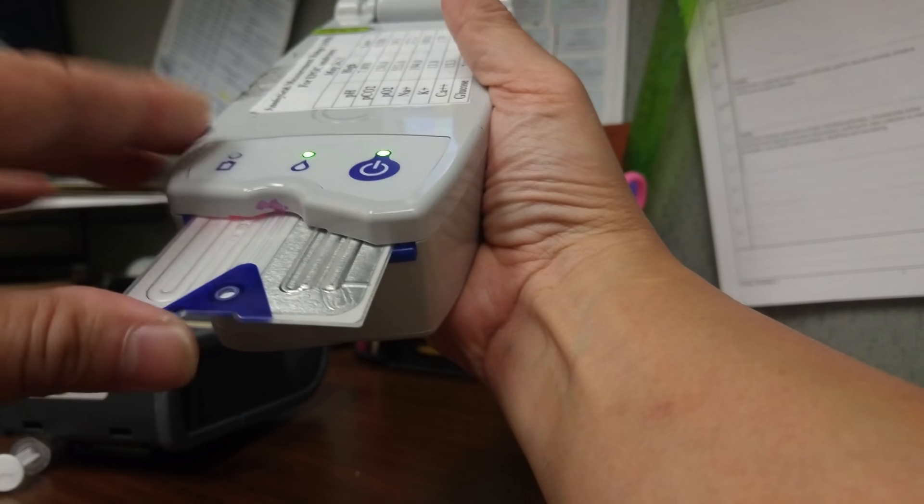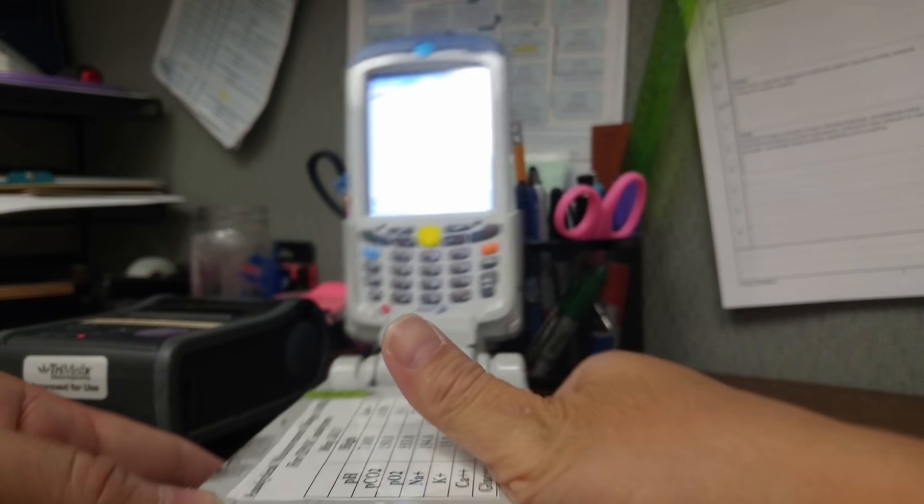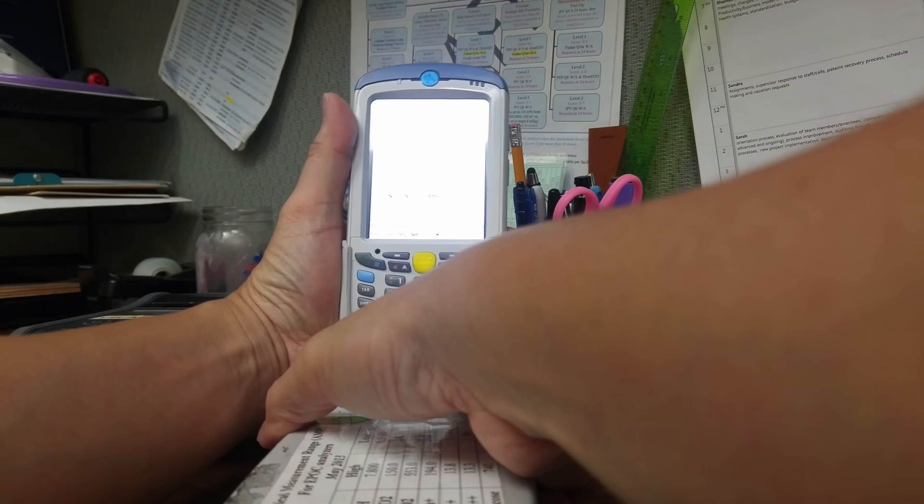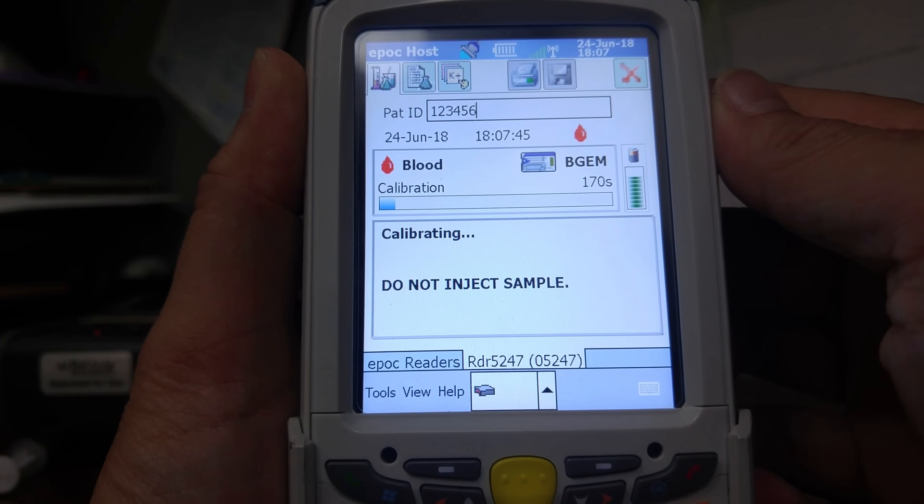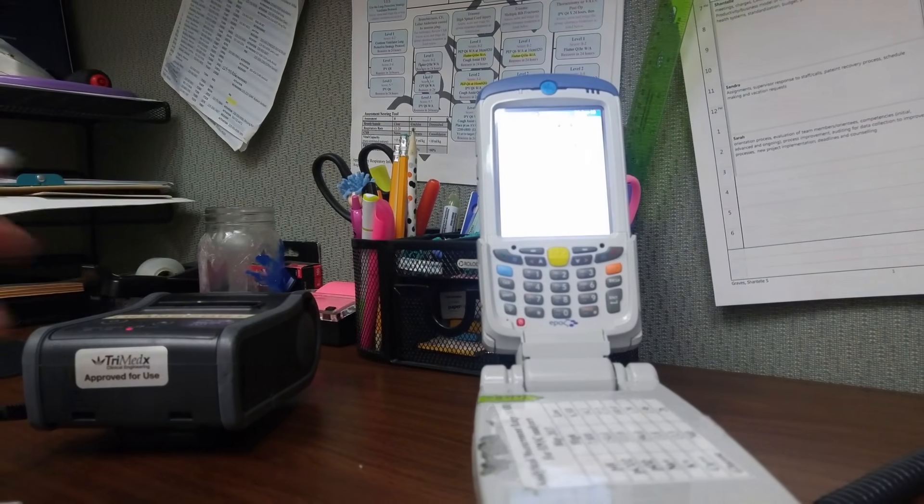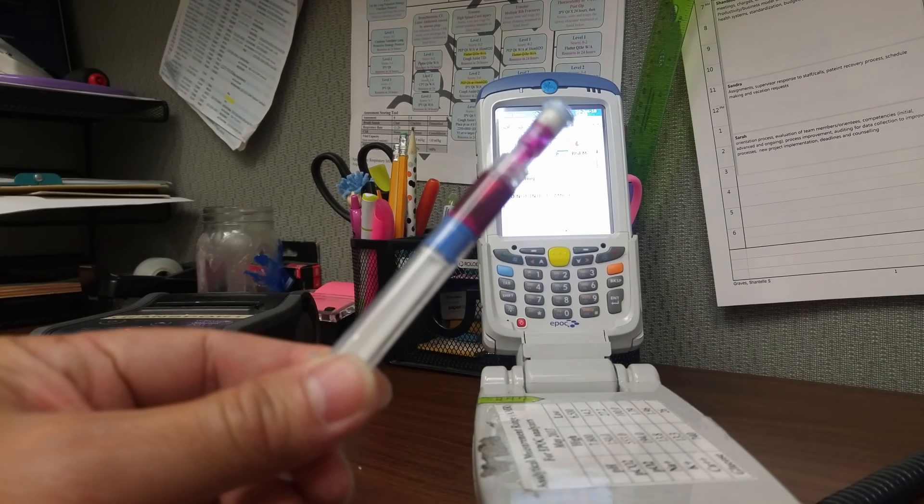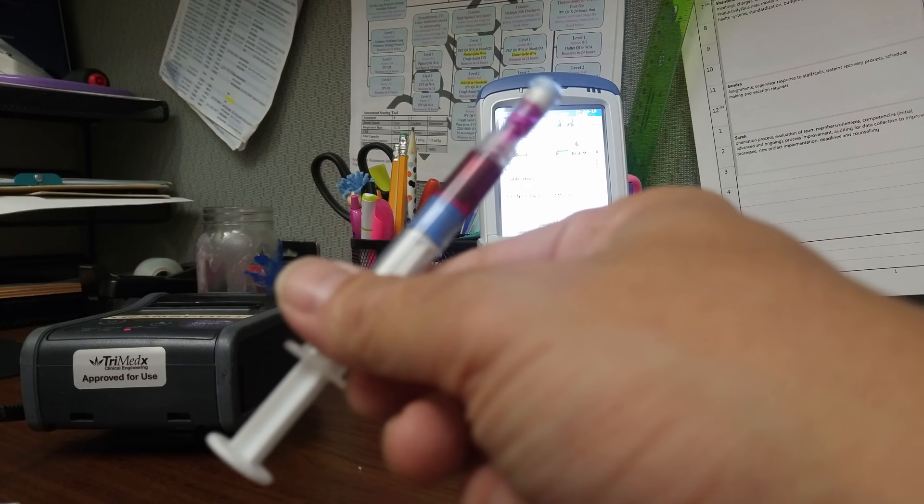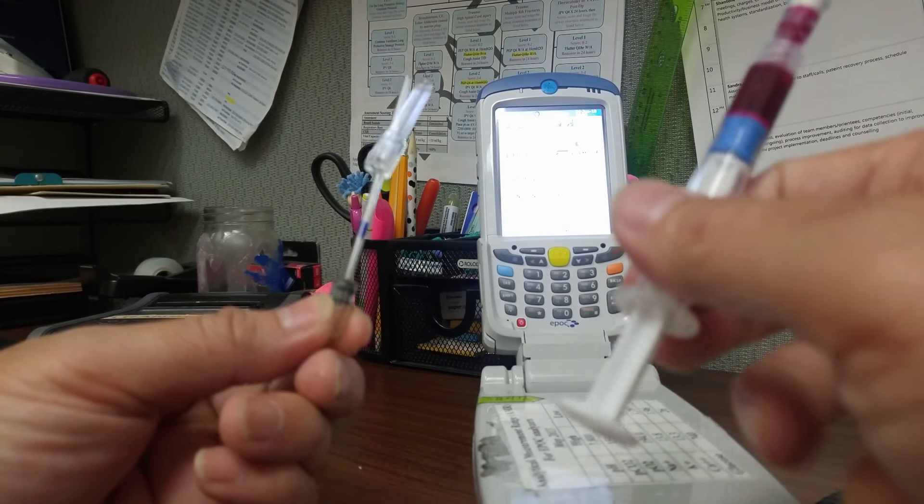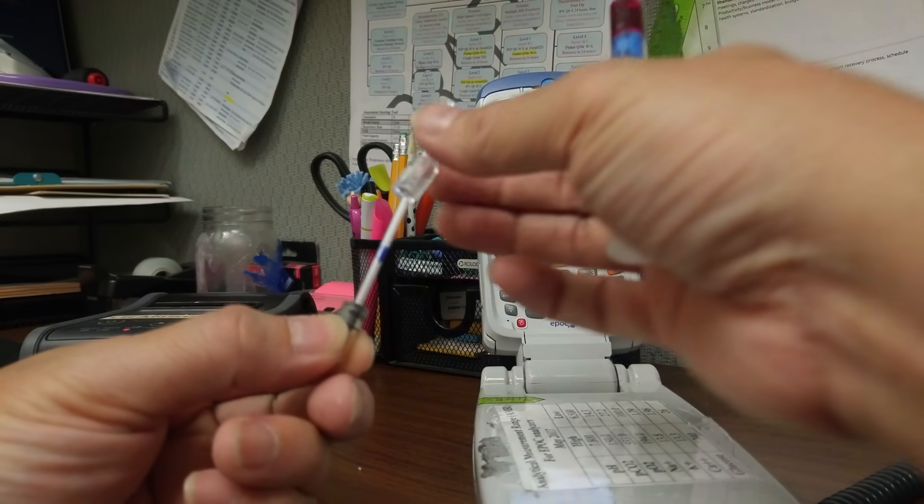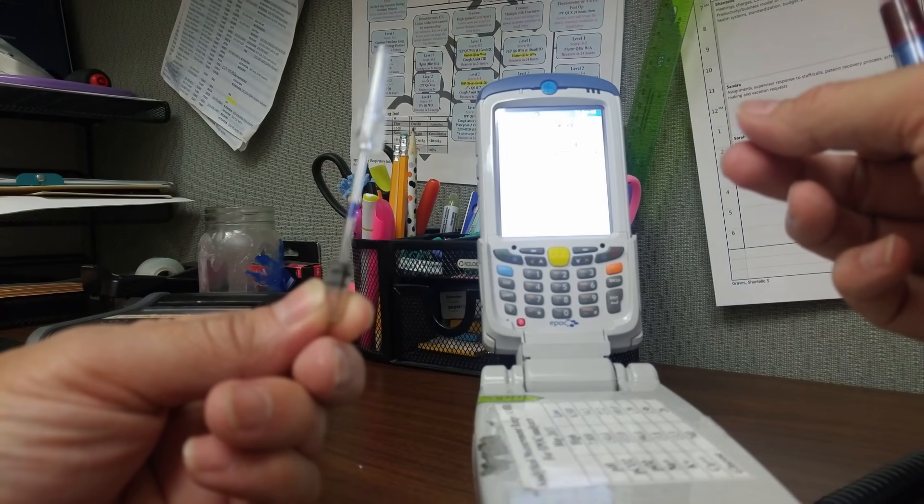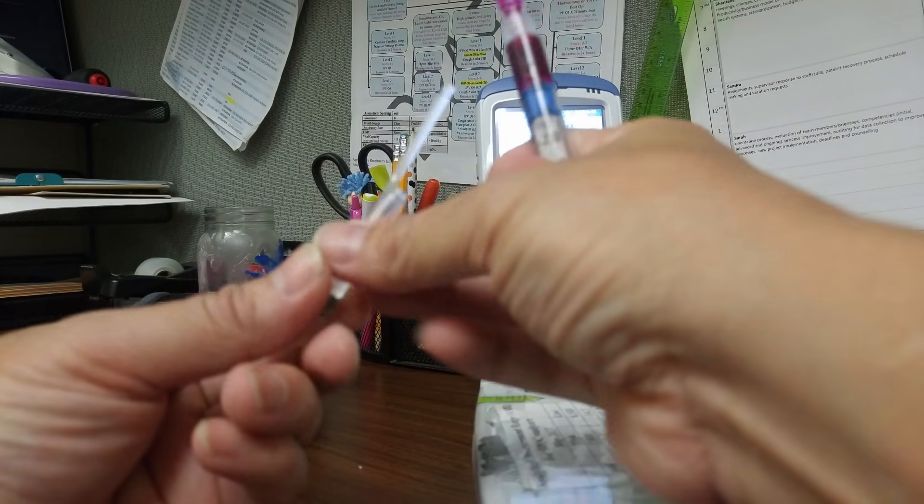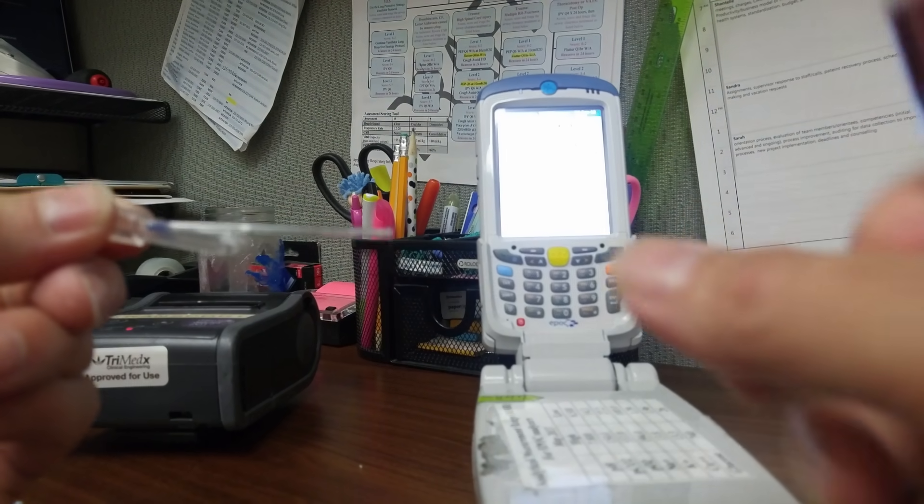One of the ways you can use a blood gas syringe, or you can use a cap tube. You need to get a capillary gas. There is a cover that goes on top which you can fit onto the card itself. You should have enough sample to go all the way to the white line.